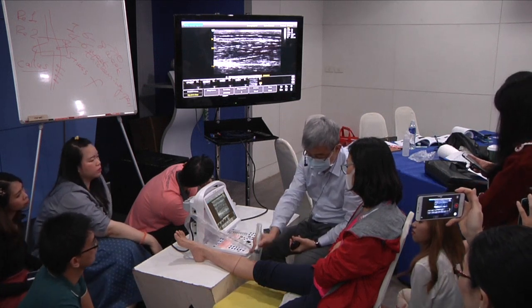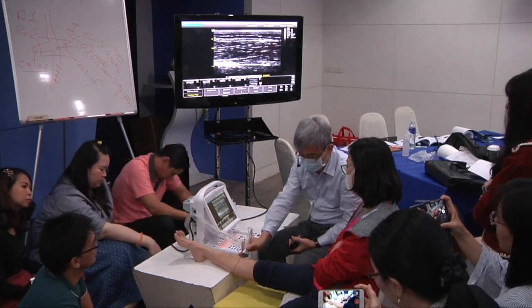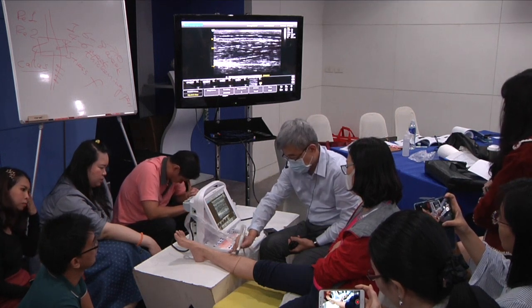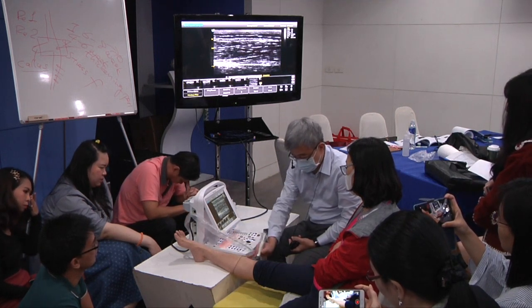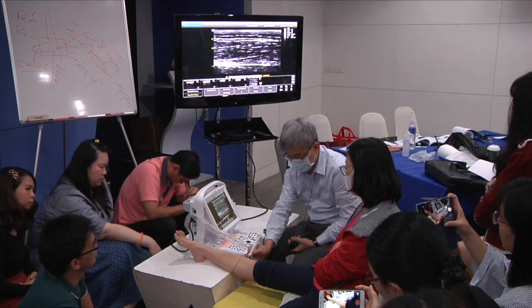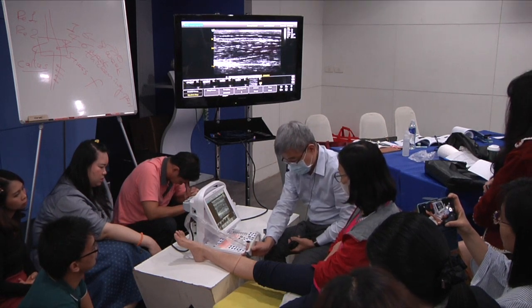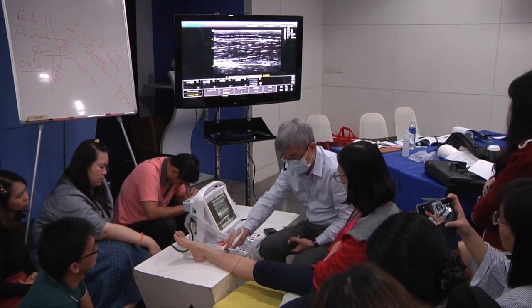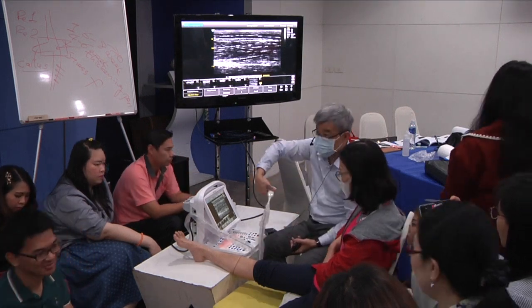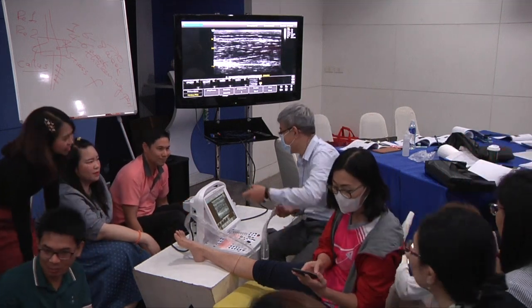3 exercises. 1, 2, find the 2 layers. Turn, contraction. 3, to the end. 4, back to the origin. Find the extensor hallucis longus. Okay, then go to the end, turn 90 degrees. Do it. Otherwise, you can go to the Amazon coffee.